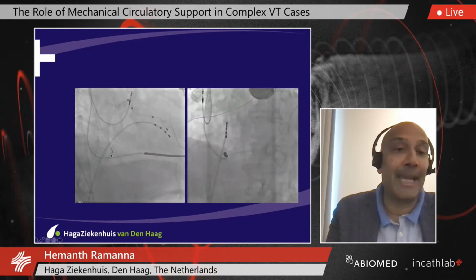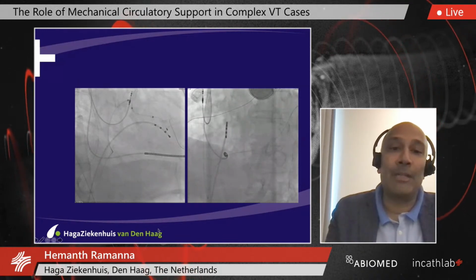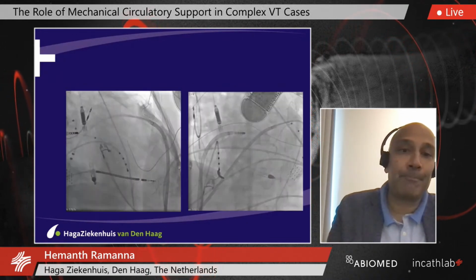We just snared it with an ablation catheter. We have done that a couple of times, and just pull it into the cava. But then with only one extra stimulus, we were still able to induce the VT. So we decided to continue with the procedure.